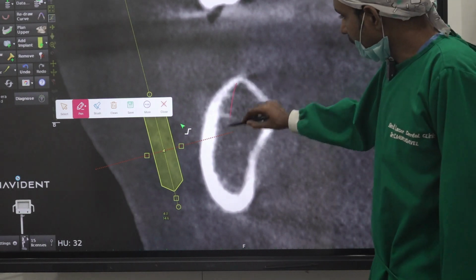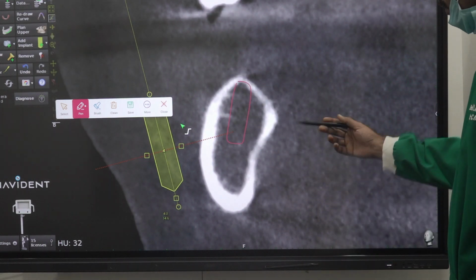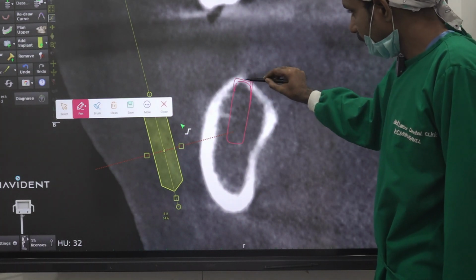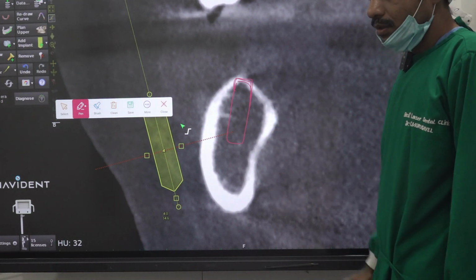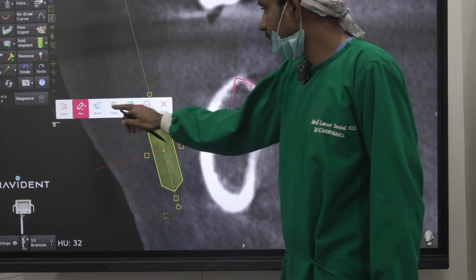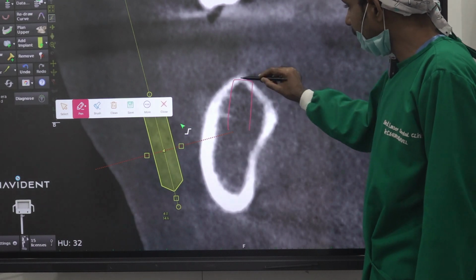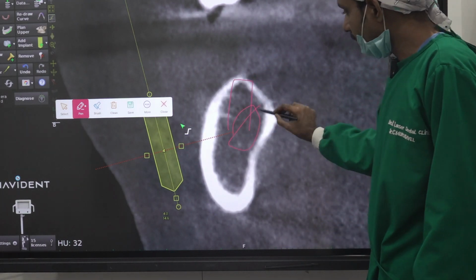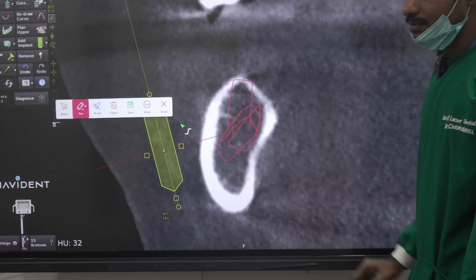If we place a conventional implant, that is also a good option for this patient. The problem with the conventional implant is there is one complication. We should be careful when we are doing a conventional implant. Suddenly the implant may go inside. If you keep the implant here, it will be stable with this 1 mm bone. If you just over insert, the implant will be lying here. Have you seen those x-rays? The implant will be lying here, like this.